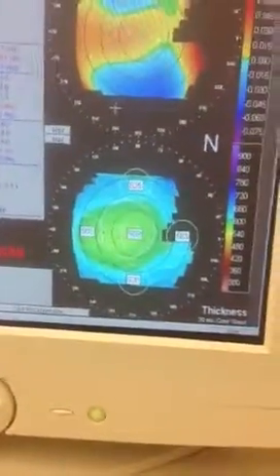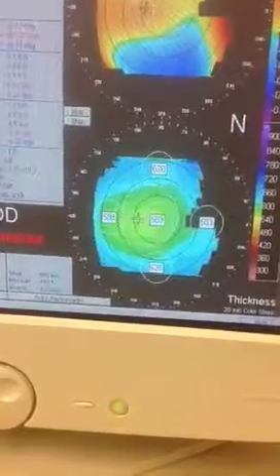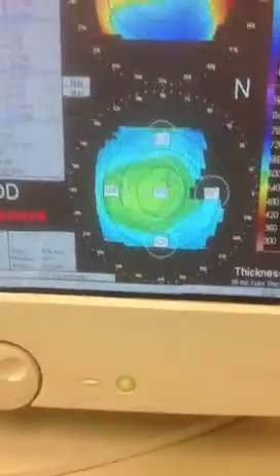So you can see on the thickness findings, see if I can get zeroed into it for you, there we go. It'll show you the thicknesses. And you can actually take your reticule and move it around, and if you look down there, you'll see the thickness is changing, so you can see where the thickness is.